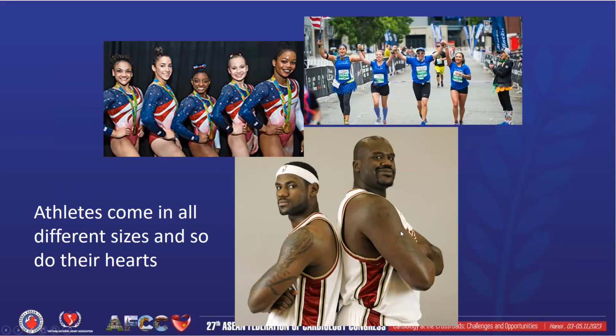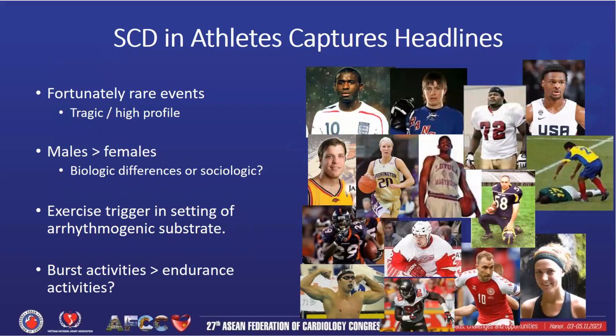One thing to know about athletes is they come in all different sizes, and so do their hearts. We have athletes who are over 7 feet tall. We have athletes who are more diminutive in stature, and we have a lot of recreational athletes who fall someplace in between. We also know from a lot of headlines that sudden cardiac death occurs in athletes, and it can be very tragic and high profile.